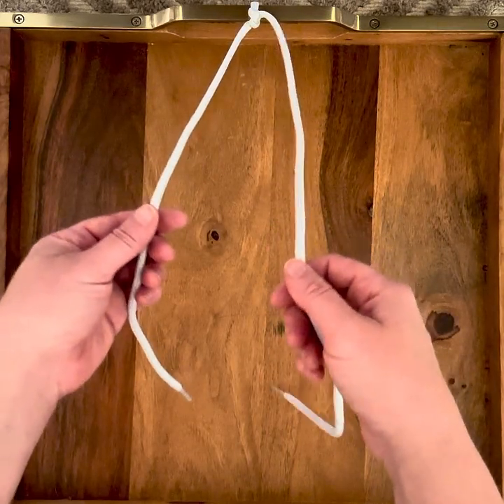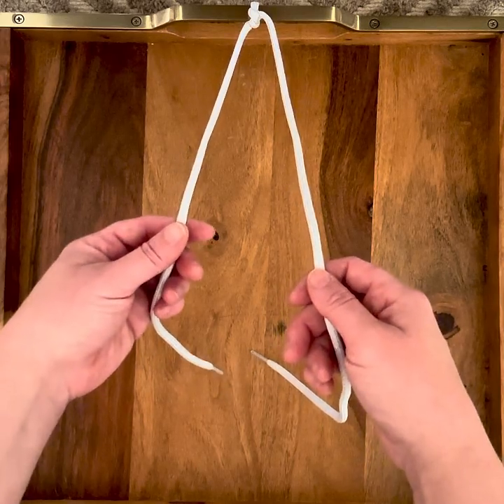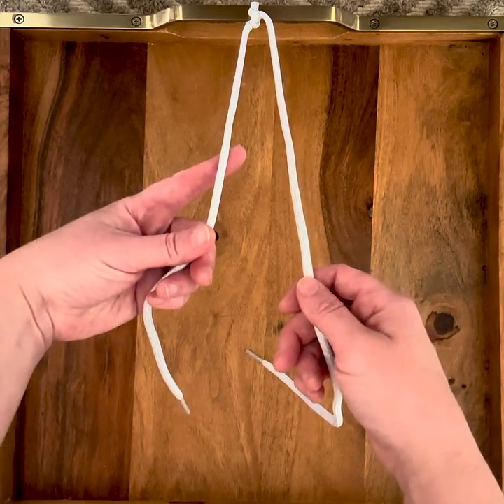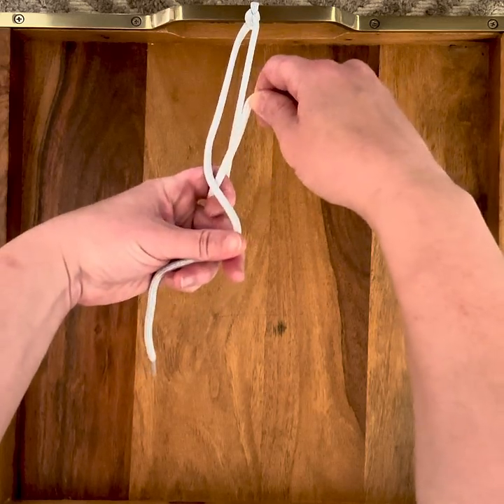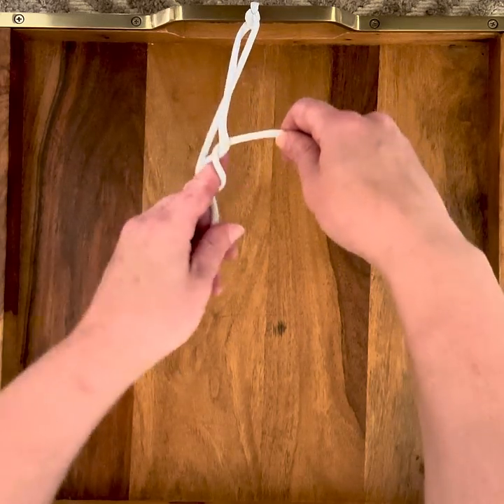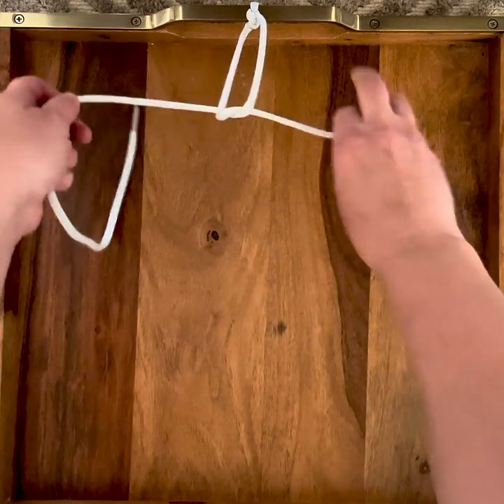I'm going to show left-handed surgical square knot, one-handed knot tying. First, move your finger forward, bring this from below, come this side, extend that forefinger, pull through, set your knot.